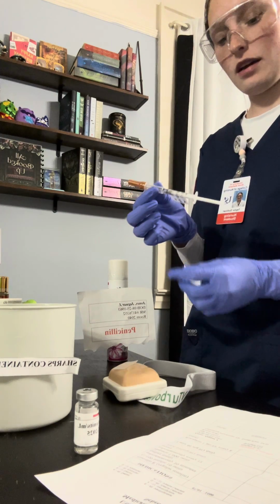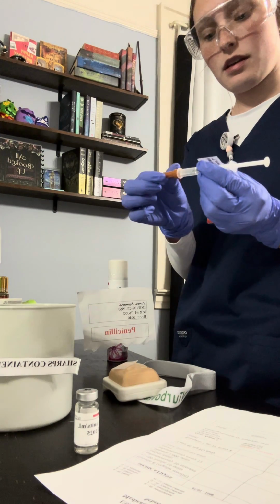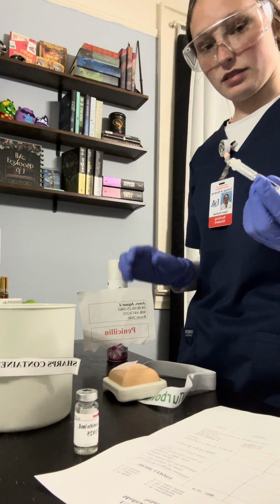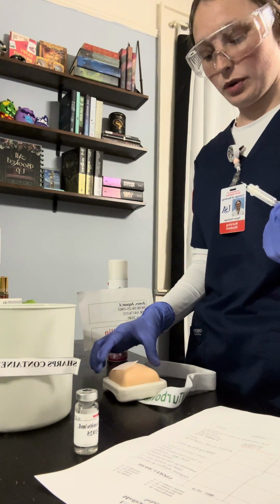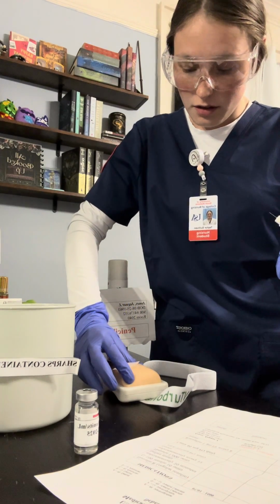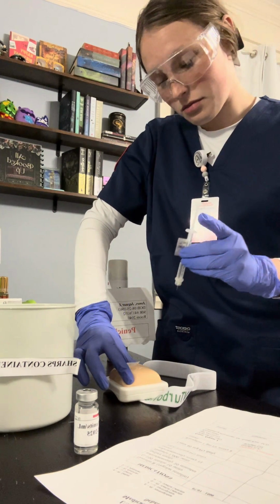So now I can take off my cap, place it in the sharps bin, and this is sub-Q, so I'm going to be pinching the skin. Okay, Mr. Jones, big poke.